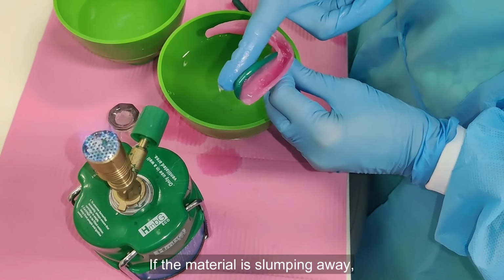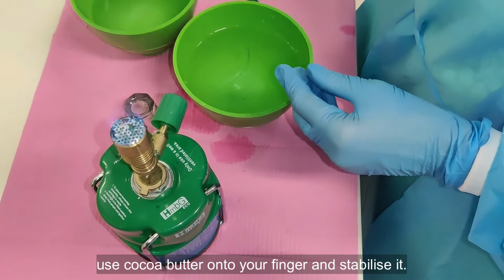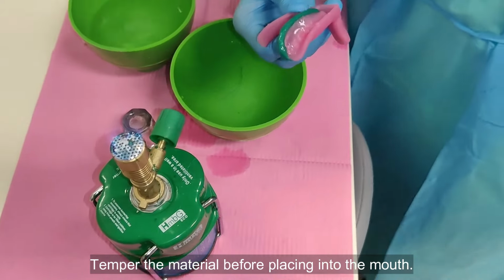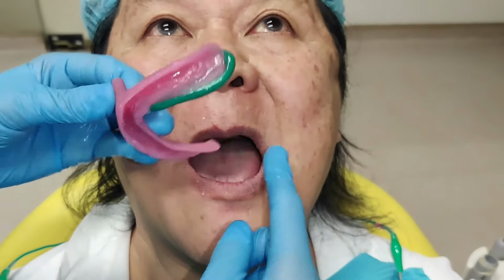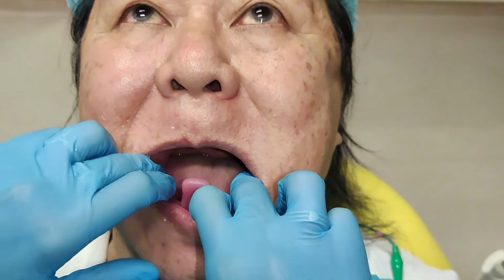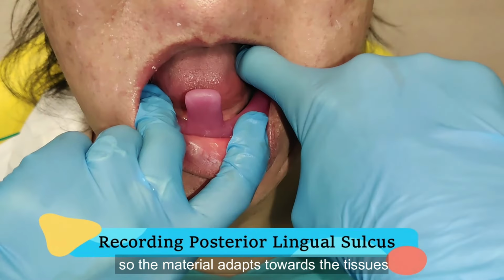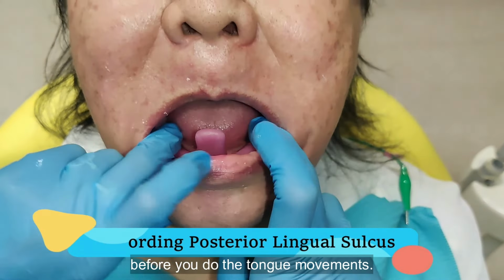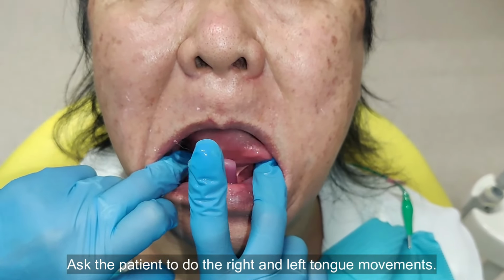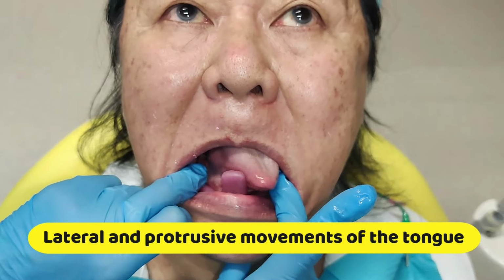If the material is slumping away, use cocoa butter onto your finger and stabilize it. Temper the material before placing into the mouth. Place the tray without touching the tissues. And a clinical tip is run your finger gently so that the material adapts towards the tissues before you do the tongue movements. Ask the patient to do the right and left tongue movements. Repeat if necessary.